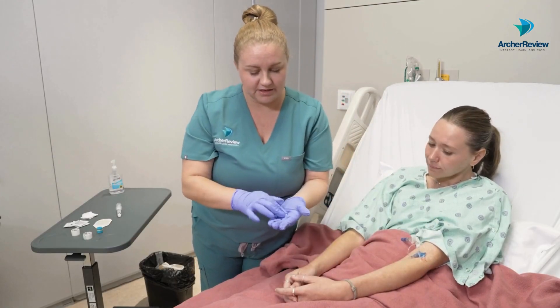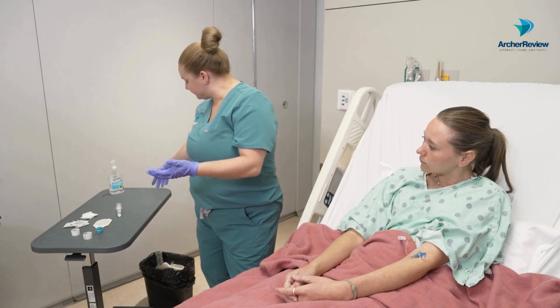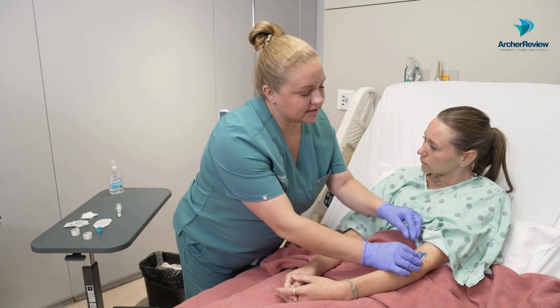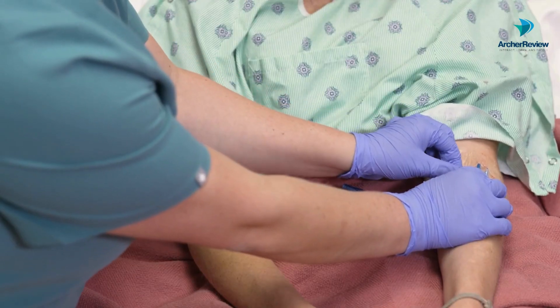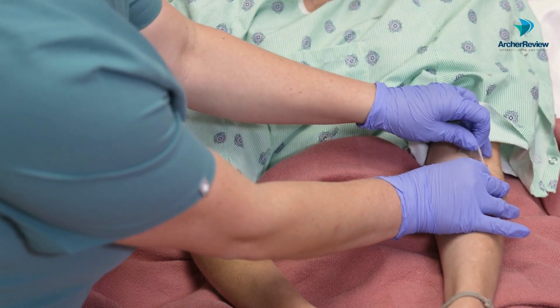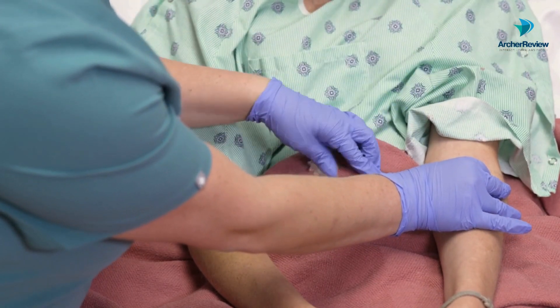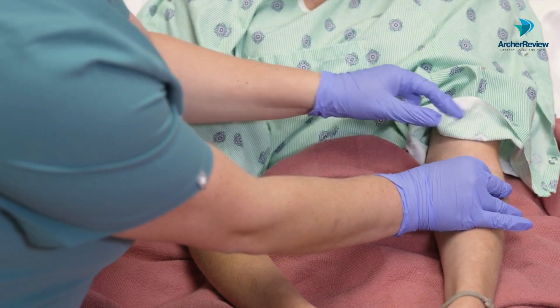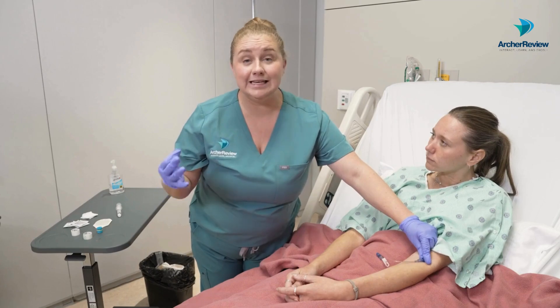We'll dispose of these in the trash. Pull this back. The important thing is to make sure as you pull the Tegaderm back, you're holding this IV — I usually go right at the hub and keep it in place. We don't want it wiggling at all. After you've got that, we're going to keep it there and go ahead and clean the site.